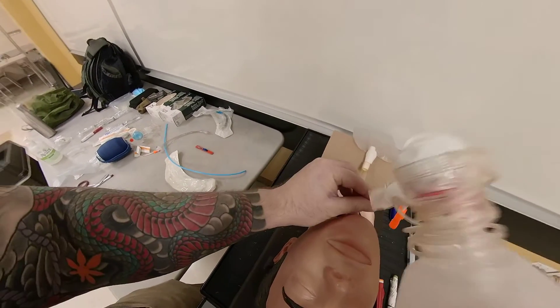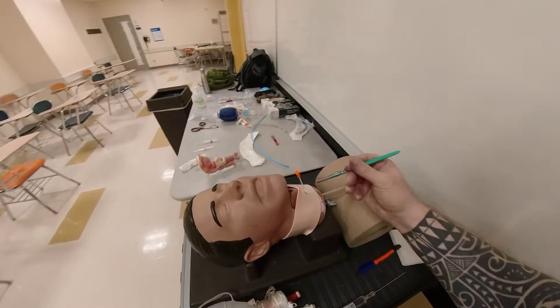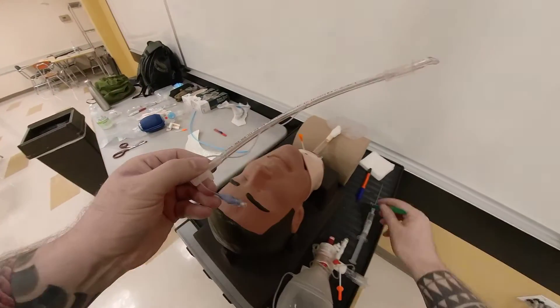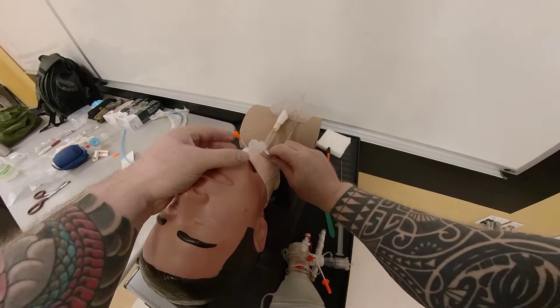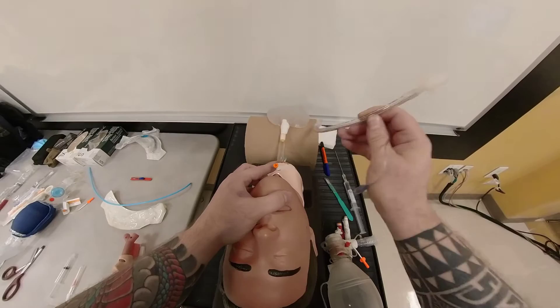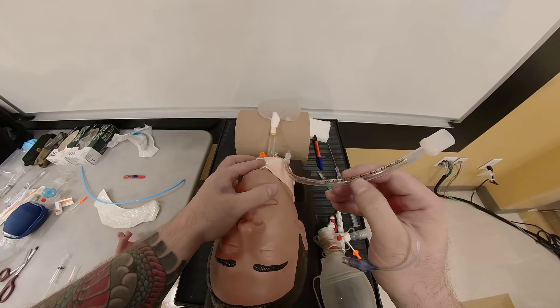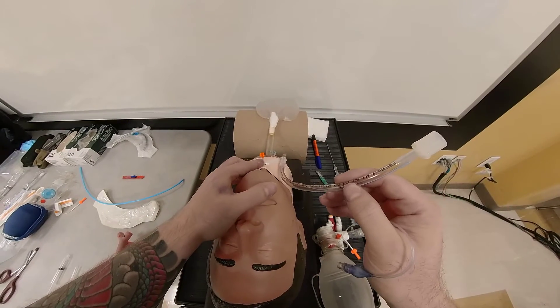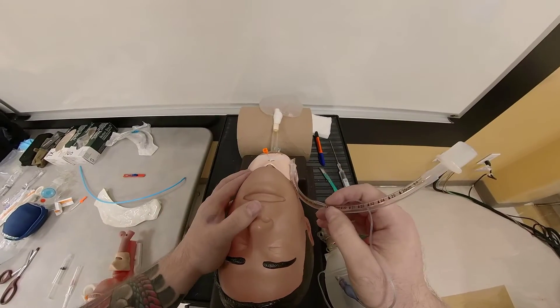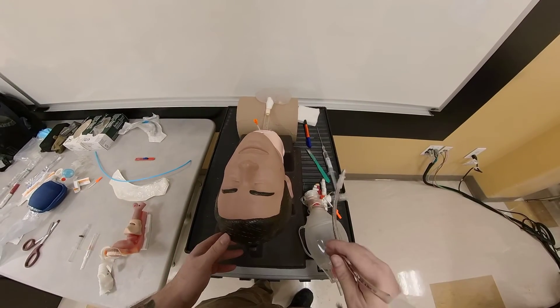This is essentially the procedure for needle cricothyrotomy. But truly, what this patient will need is a surgical cric — an incision with a 6.0 ET tube placed. Just based on diameters alone, this 14-gauge catheter can never compare to an endotracheal tube, for which you can get oxygenation and ventilation. This you cannot. Plus, the ET tube definitively controls the airway, which the catheter does not. Once you bring this patient to the hospital, they'll still need to perform a surgical cric in order to gain access to the airway.